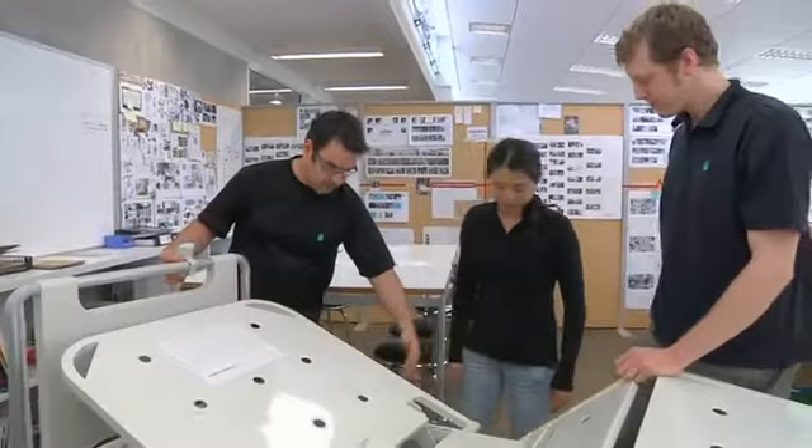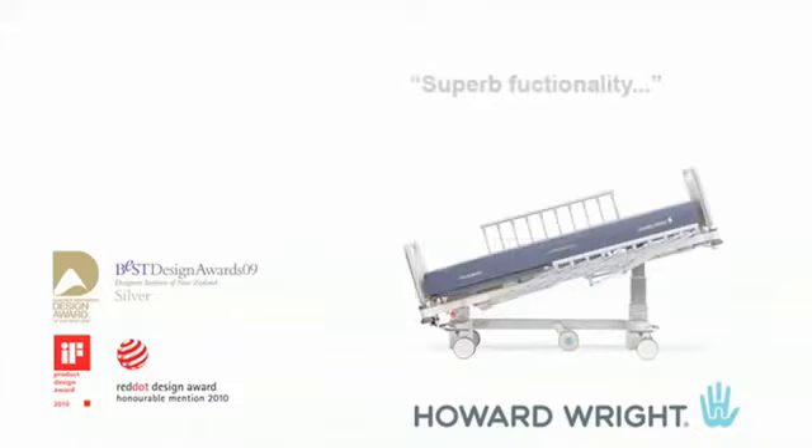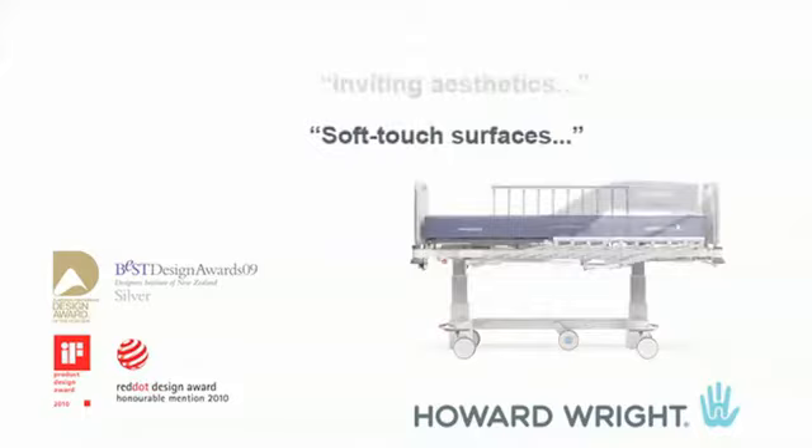But how could Howard Wright's design team improve on an already top design? The new M9 benefits from the extensive research and development put into Howard Wright's M8 intensive care bed, which has won no less than four international design awards for its ease of use and extensive functionality.